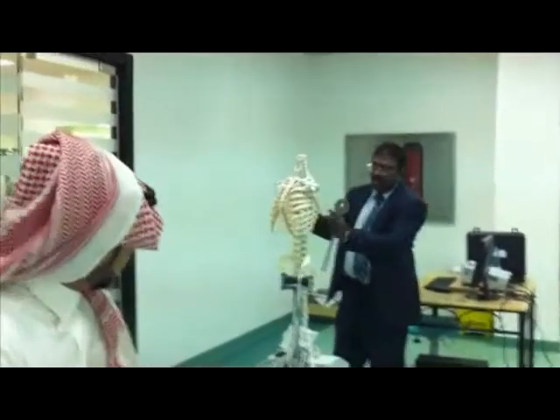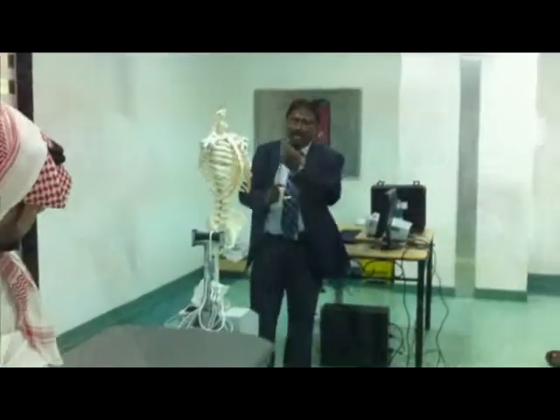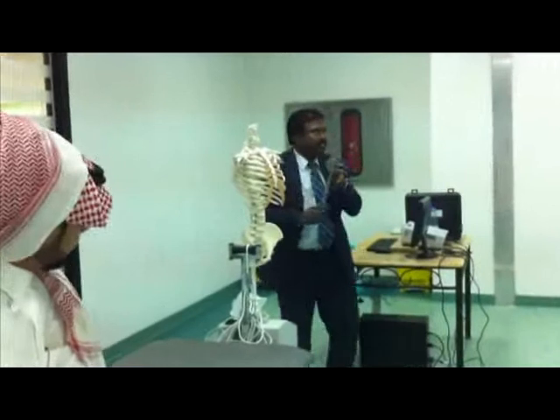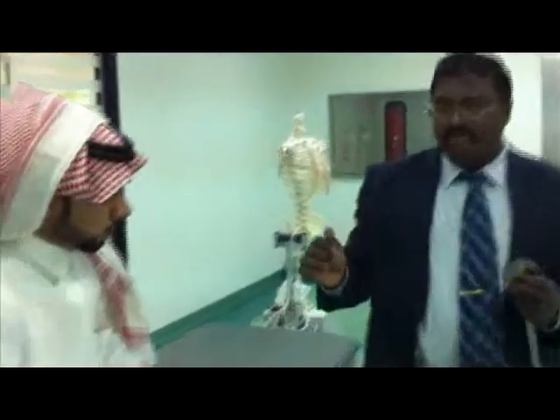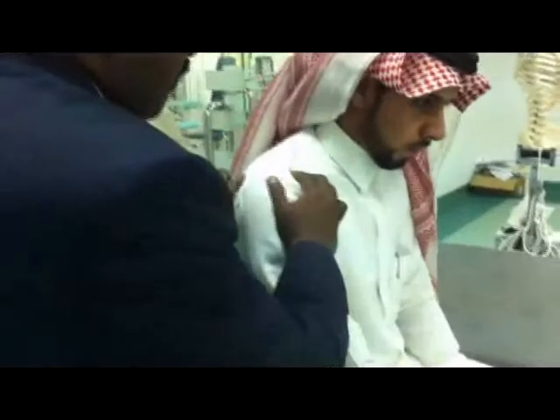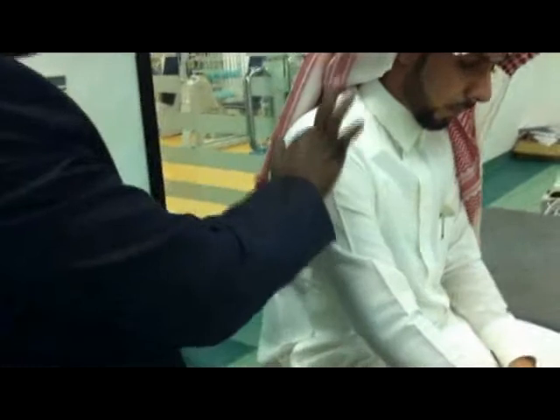You know the scapula? This is the scapula. The spine is the fulcrum. That means you should put the goniometer there for doing flexion and extension. To palpate the fulcrum, palpate the clavicle and come to the end of the clavicle — that will be the acromial process.